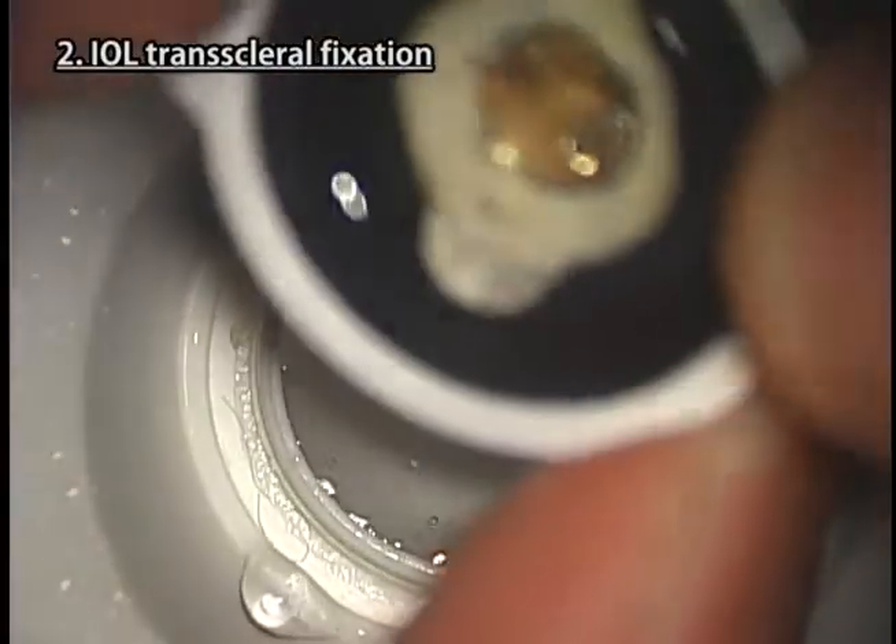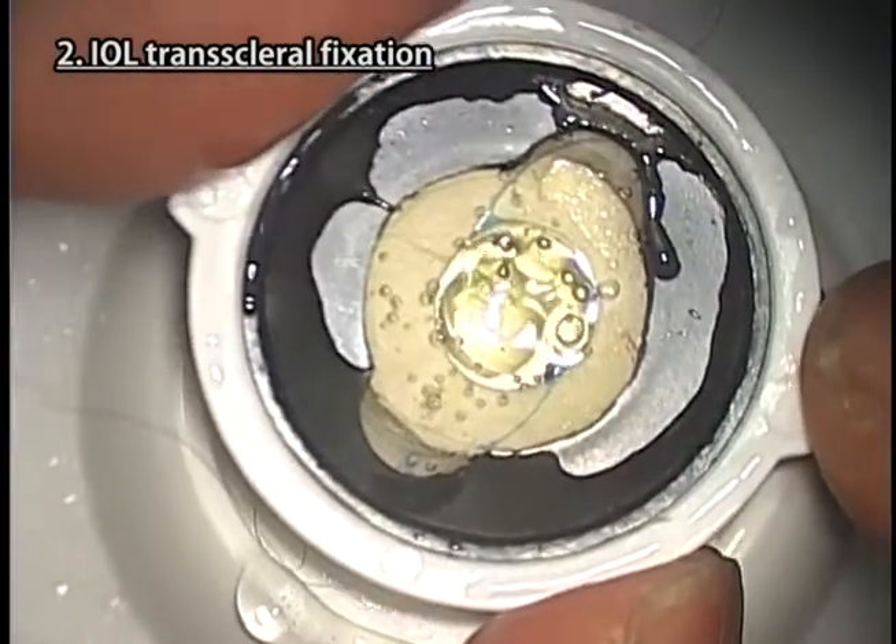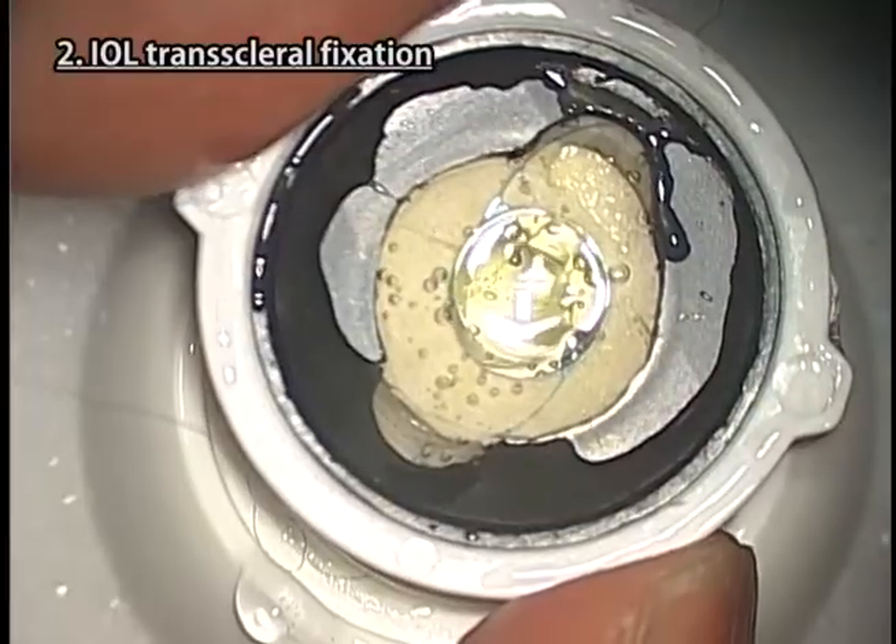At the end of practice, you can check how the IOL is fixed to the sclera by observing the cornea iris part from the back.